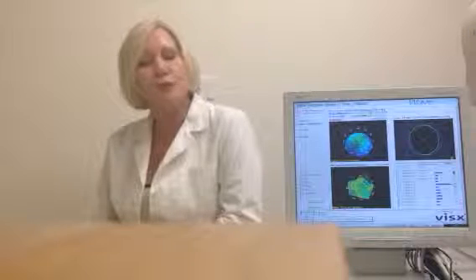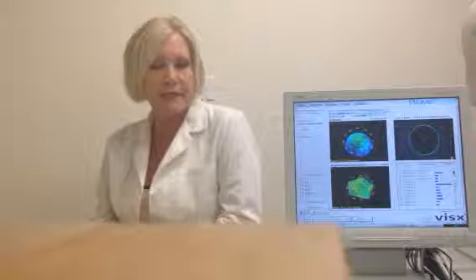Once you've completed your questionnaire, we do give you a tour of the office, and we show you where the laser procedure is performed. Our series of extensive visual exams will then tell me whether or not you're a good candidate for the procedure. So what do we measure during this exam? Well, first of all, we have you take off your glasses or take out your contact lenses, and both my staff and myself will measure what your vision is without your optical correction.